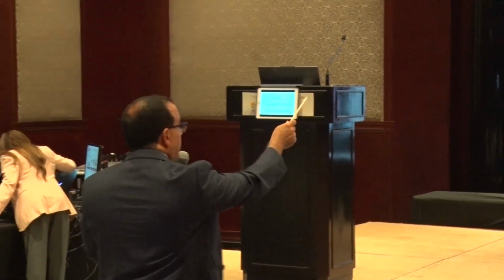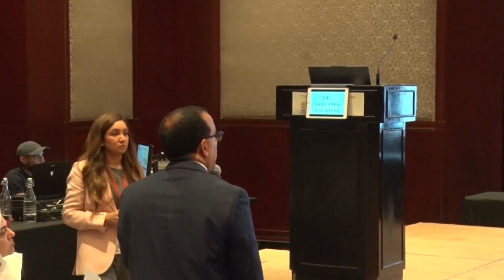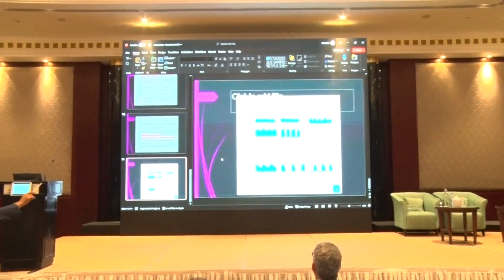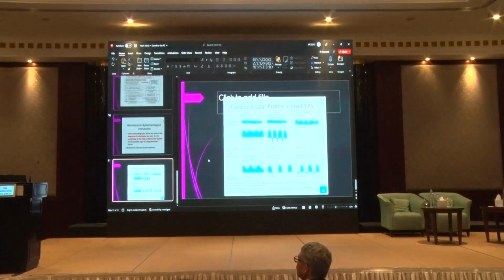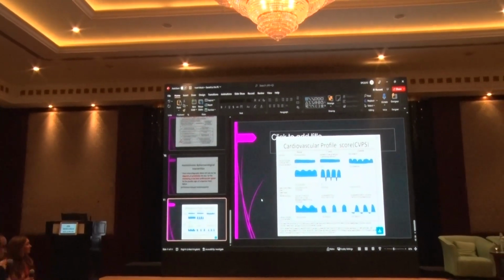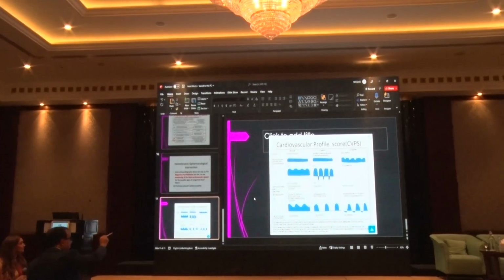So what we saw there is, here you go, very nice. This is the Dr. Hota cardiovascular profile, and usually whenever I do a patient, especially if there is something wrong, I will also mention the cardiovascular profile and add it as a point. Do you use this, Dr. Iram? No, I only researched it for the conference. Okay.